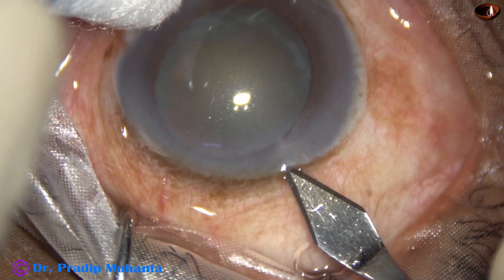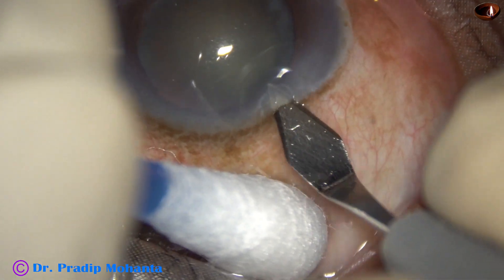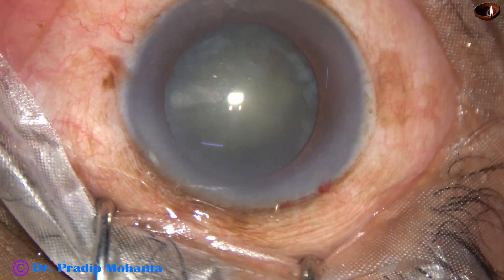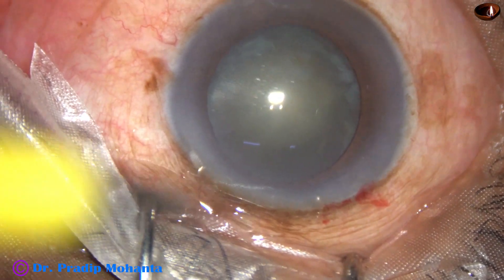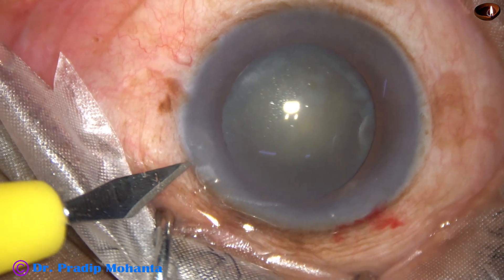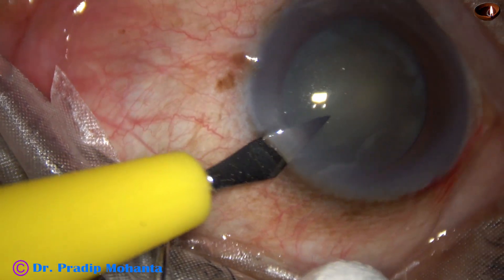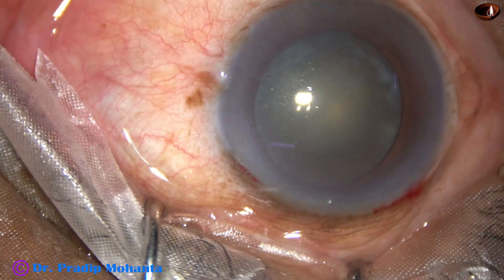This is the main incision with a 2.8 mm steel keratome at the posterior aspect of the limbus. A side port is made on the left side of the main incision, about 3 clock hours away from the main incision.